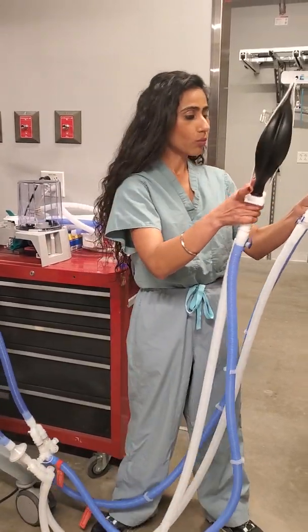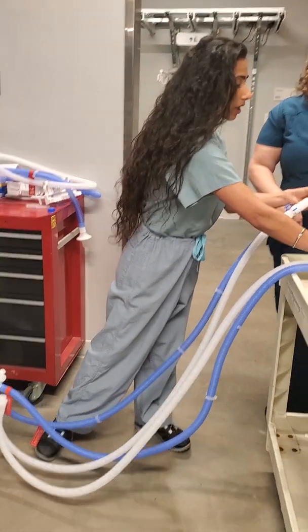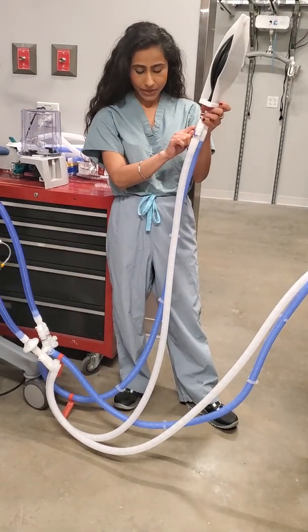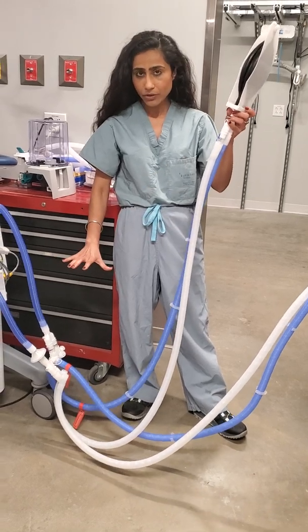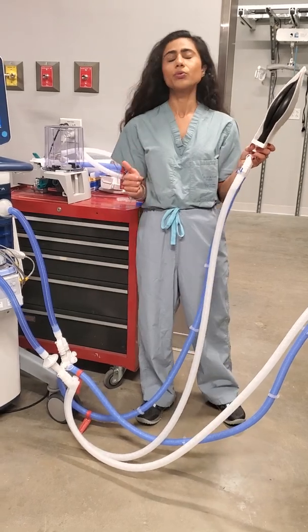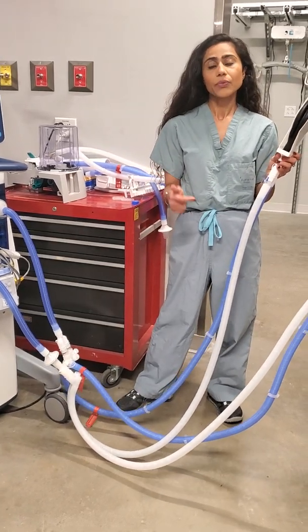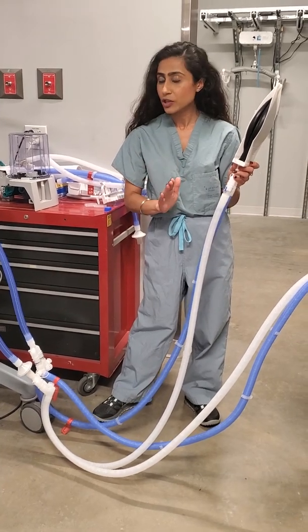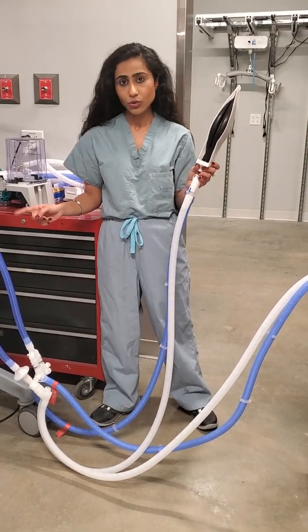In terms of supplies — each circuit comes with its own Y piece, and for this method I ended up using two Y pieces per patient. So what you would need to order is one extra Y piece and two one-way valves per patient you intend to connect to the ventilator.